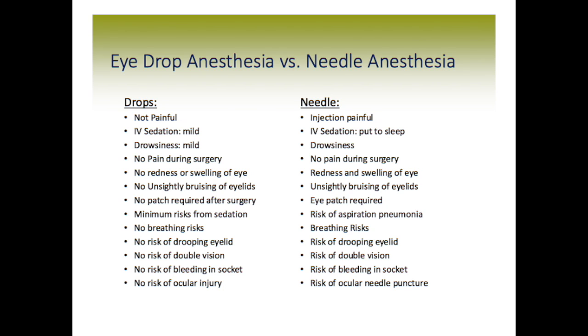As far as numbing drops go, you're not going to get bleeding in the socket, but it can occasionally occur with the needle in the socket nicking a blood vessel, so that you can have a serious bleed in the socket. Usually all that is required is to postpone the surgery, let that resolve, and come back weeks later and then do the surgery.